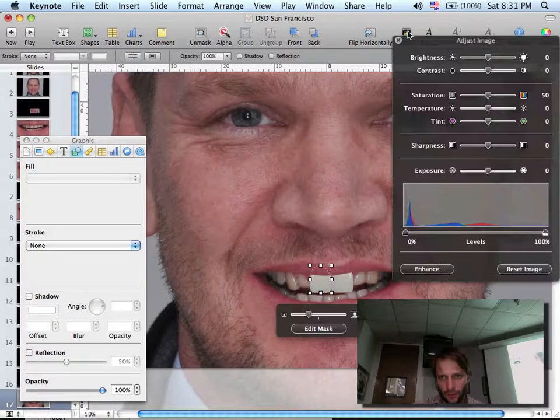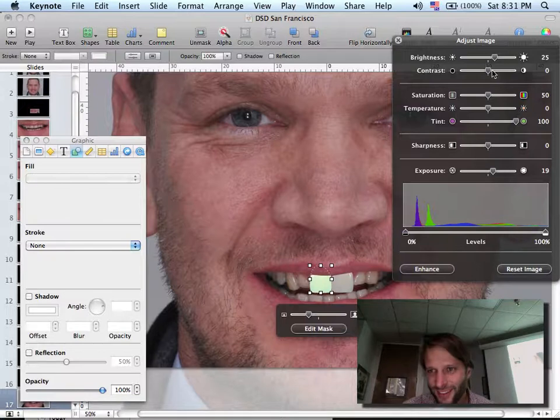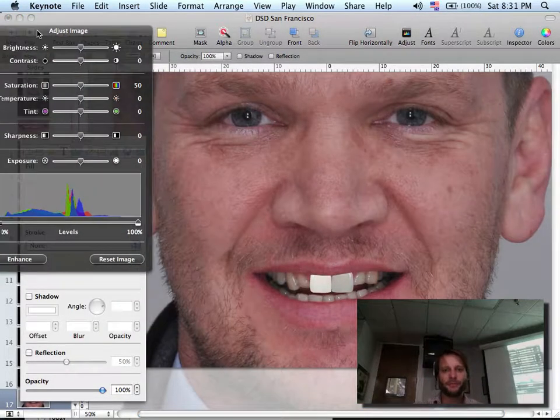And you can have the whole six anteriors. Now you can bleach. You can make them very nice and pink or green. But anyway, this is just the maximum type of simulation that I can do on Keynote, and that I want to do, because I can go on Photoshop or any other specific software and make amazing simulations and make them disappear completely, so you make a perfect smile and you don't see that it's a simulation.